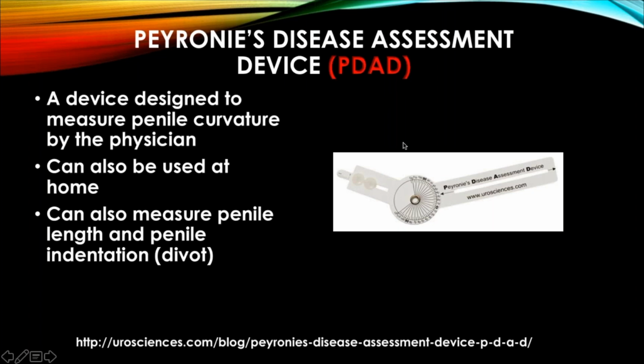Peyronie's disease. This is very important to document when you're evaluating a patient during a penile Doppler ultrasound, because many times a patient's description of their penile curvature will not correlate with what you see in the Doppler ultrasound. Many times the injectable agent that we give the patient will give them an erection that is significantly firmer than what they experience at home. So the degree of curvature can be significantly greater during the test than it is at home.